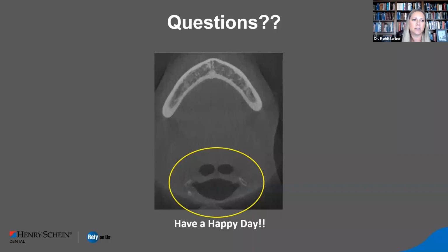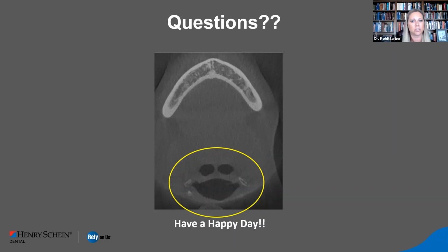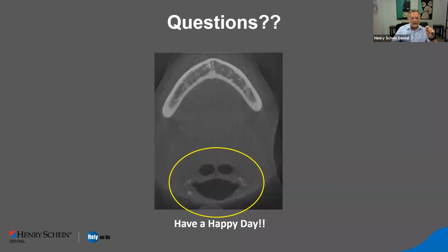It's not a huge issue, but with some of the ones we showed here, they had an extensive amount of continued inflammation. In that case, you want to send them to ENT and have everything cleaned out and just start over again. It's just that the body is continually trying to wall that off, and it's caused a chronic inflammatory process.